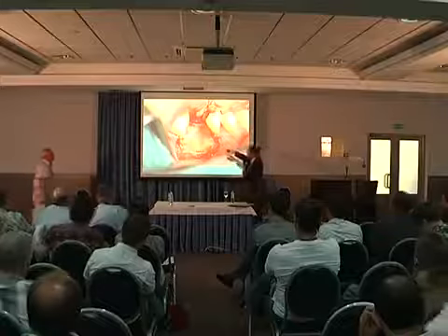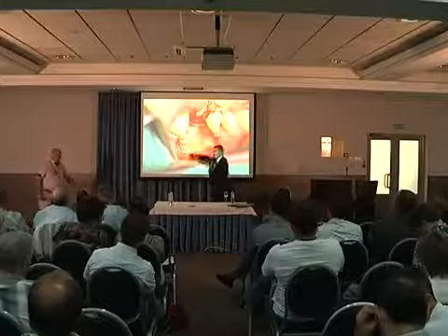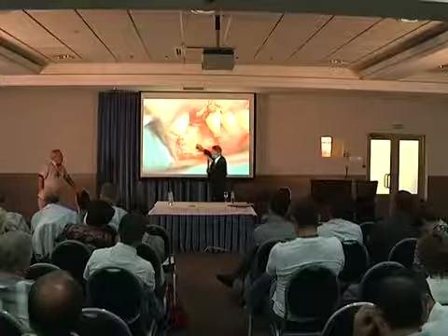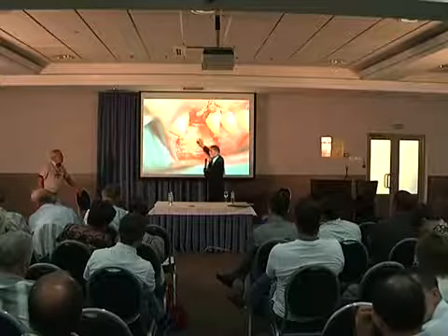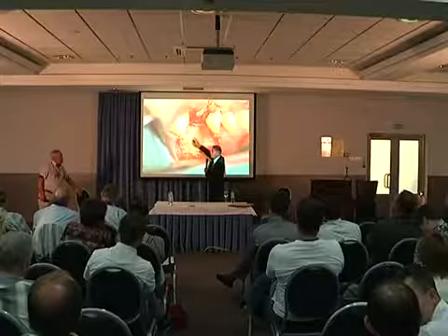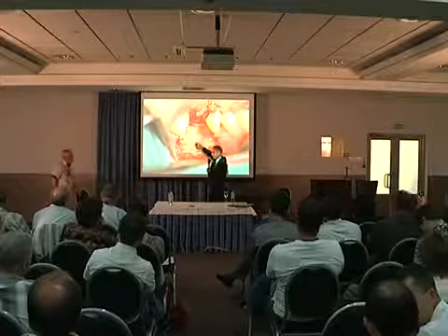Yes, the fibrin membrane, another 2 very important effects. Effect number 1, increase the stability of our bone augmentation grafting material, and soft tissue healing effect, avoid dehiscence.